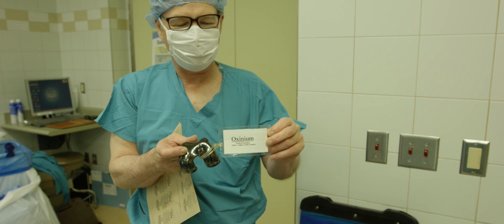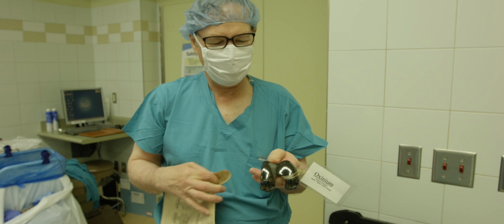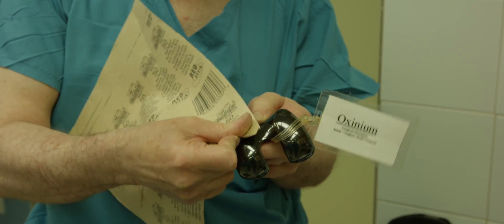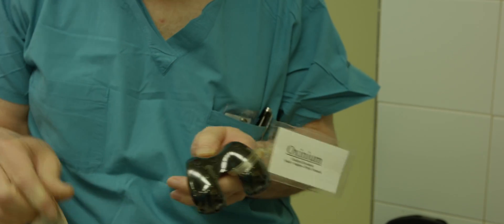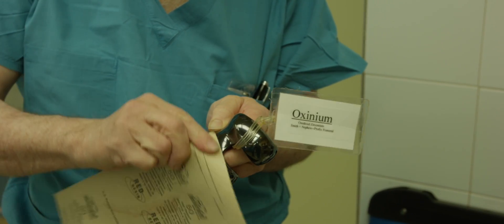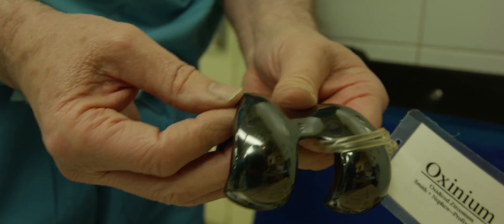Then I'm going to use a couple of examples of this. This is oxinium — it's a knee implant. There's the scratch it gets.